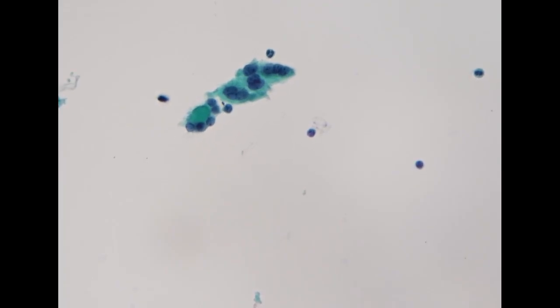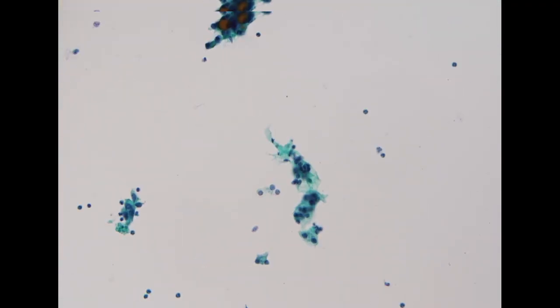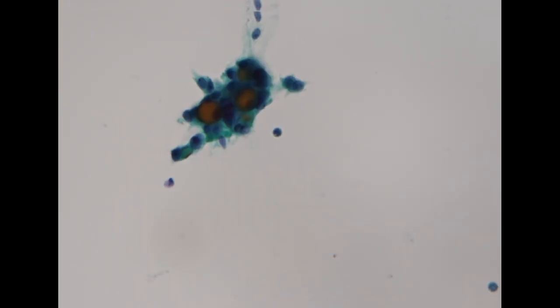In a long-standing follicular lesion, sometimes the nuclear atypia will be quite prominent. But unlike papillary carcinoma, for papillary carcinoma, most of the time the nuclei are relatively uniform. It shows a diffuse nuclear atypia change, and it won't show significant variation in size.